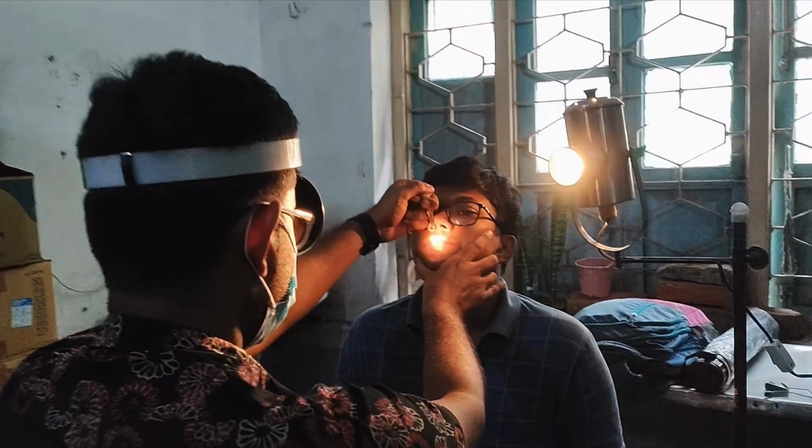Now coming to anterior rhinoscopy. Again, it is a repetition, but I'll still say again, you need the bullseye lamp, you need the head mirror, and you need a Thudichum's nasal speculum, which I am holding. I am holding the Thudichum nasal speculum in my non-dominant hand, so that my right hand is free to perform any procedure if necessary. Suppose while removing a foreign body, we can use the Tilley's forceps or perhaps a nasal foreign body hook to remove a foreign body from the nose. For that, our right hand is free. See how I have held the Thudichum nasal speculum in my left hand.